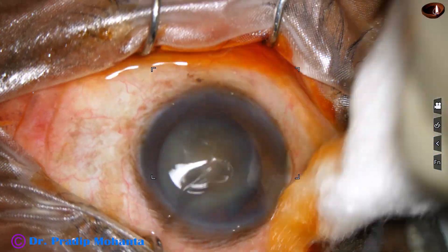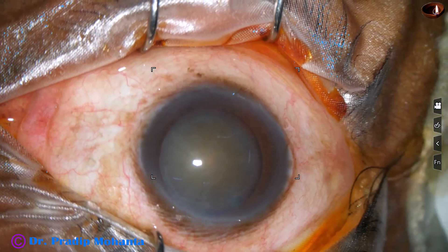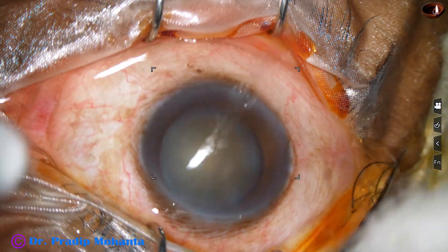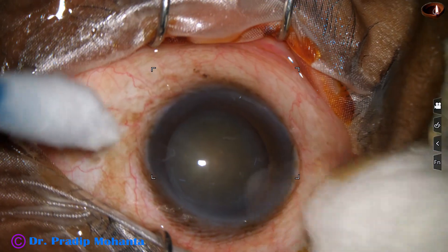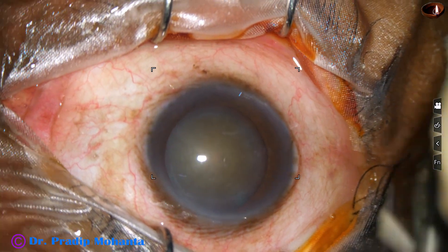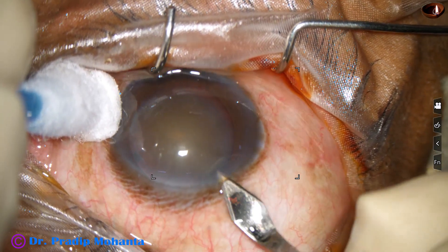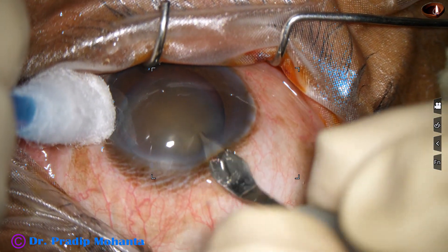This is a cataract with pseudo exfoliation. We know that when cataract is associated with pseudo exfoliation, there may be weak zonules and there may be raised intraocular pressure. The patient may have open angle glaucoma. Let us observe this totally unedited recording.